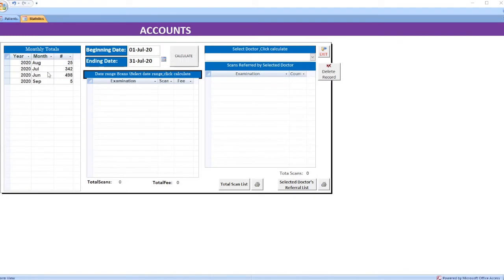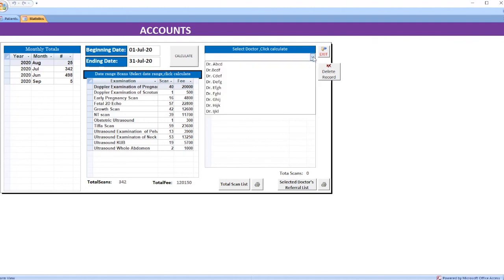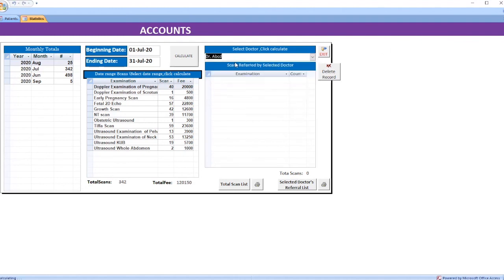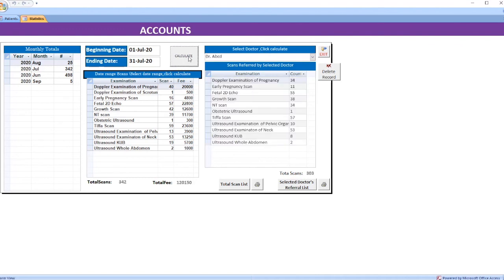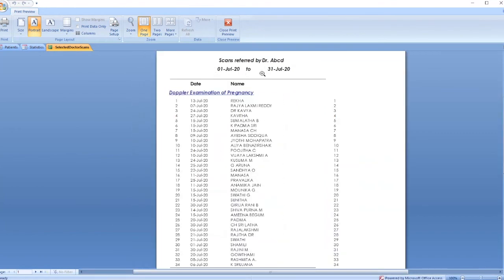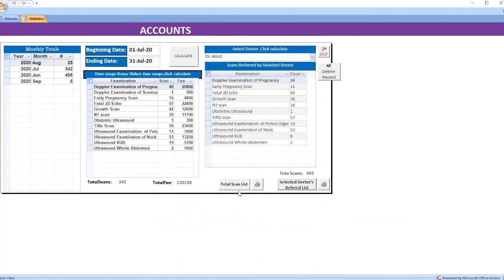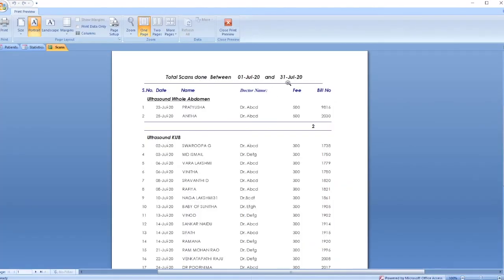In the accounts section, you will see the monthly totals and date-wise totals. Select the beginning date and ending date and click calculate — you will see the scans done during this period. If you want to see a particular doctor's referrals, select the doctor and you will see the referrals during this period. You can also print the list of scans done by a particular doctor during this period, along with the total scans.